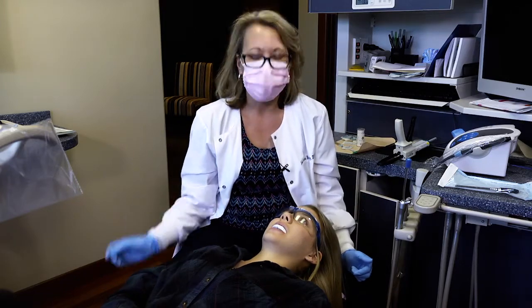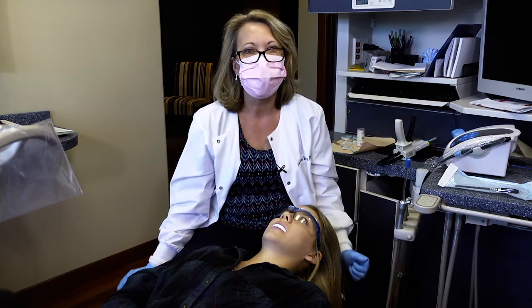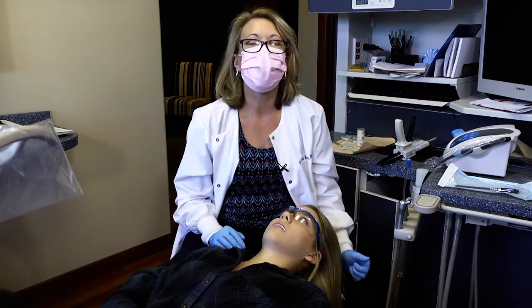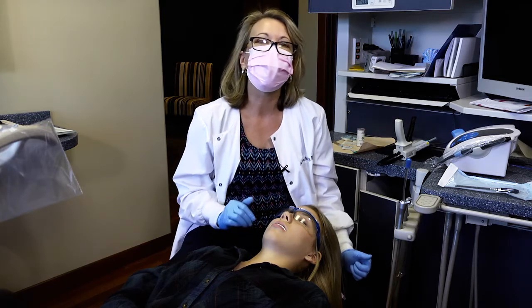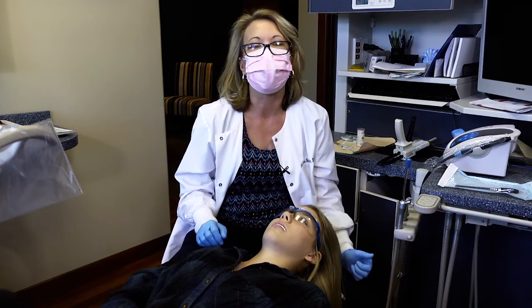Quick and simple, we've fabricated a quick splint so that Jenna can rest on it during her procedure, or take it home after her procedure as part of her home care protocol. And if Jenna was already post-op and experiencing some symptoms, we could actually use this as a therapeutic device to help her get better and get past that as quickly and efficiently as possible.